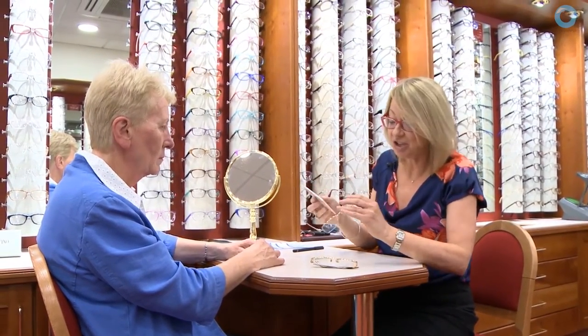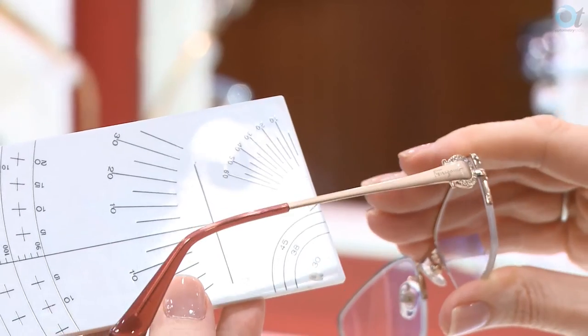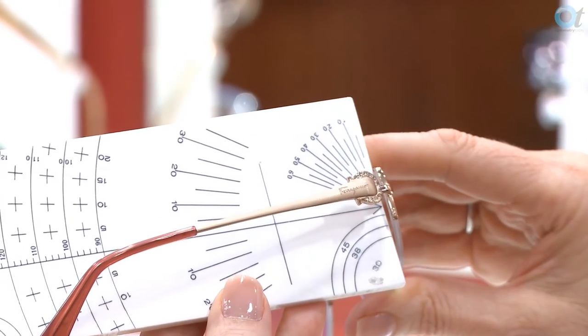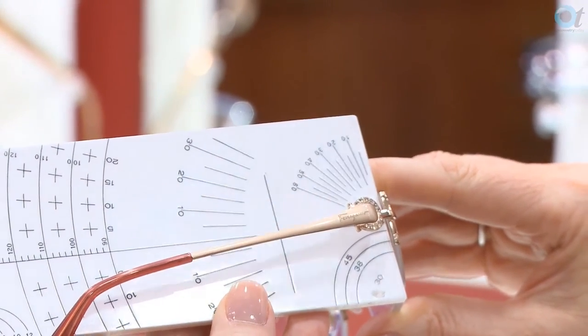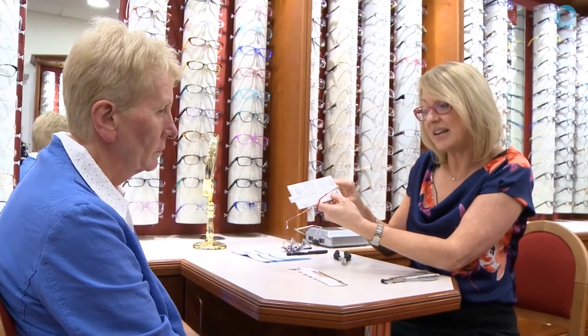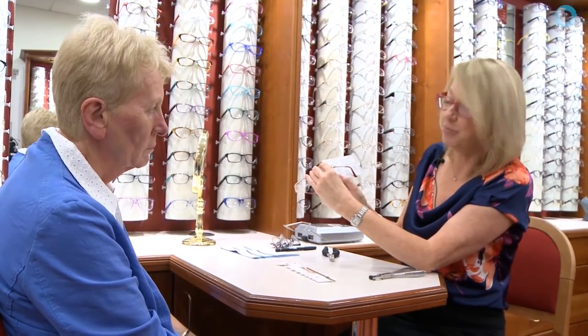My next task is to measure the angle of side. I'd make a note of it — place the zero into the middle of the joint, the flat of the rule flat onto the back of the frame, and measure through the middle of the side. The angle of side is nine degrees. When dispensing universal progressives, the angle of side has to be 10 degrees because standard progressives are pre-decentred to be fitted at a 10-degree tilt. If you use free-form progressives, they can be dispensed at any angle of side because they're made-to-measure progressives.